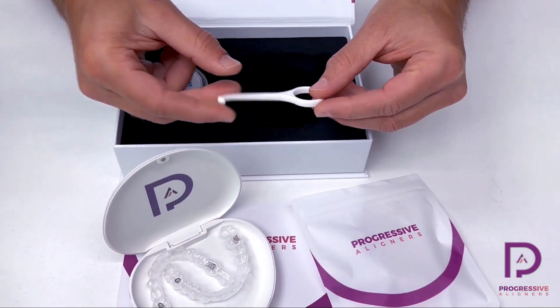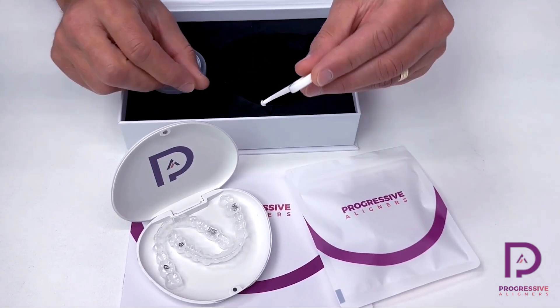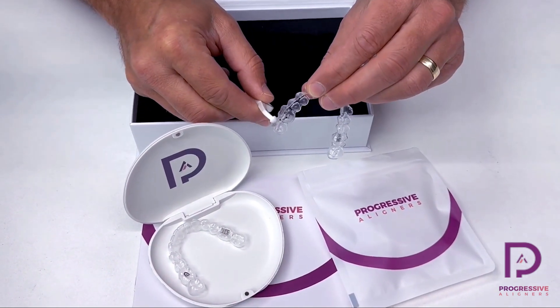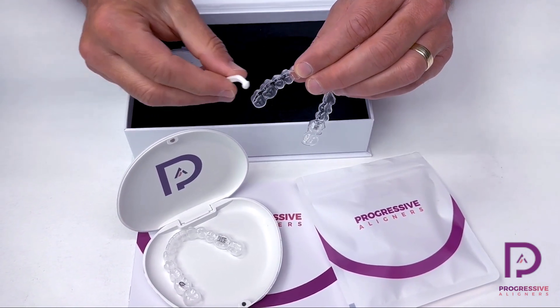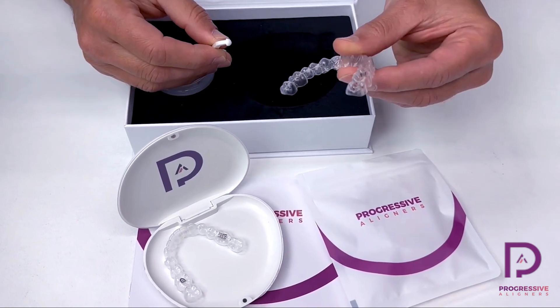Also, they'll have an aligner removal tool. This tool has got a nice edge on it for them to be able to reach into the back of their mouth and grab the edge of that aligner and pull it down if they're having a hard time doing that with their fingernails. This removal tool is real helpful for some people in getting the aligner to come out of their mouth.